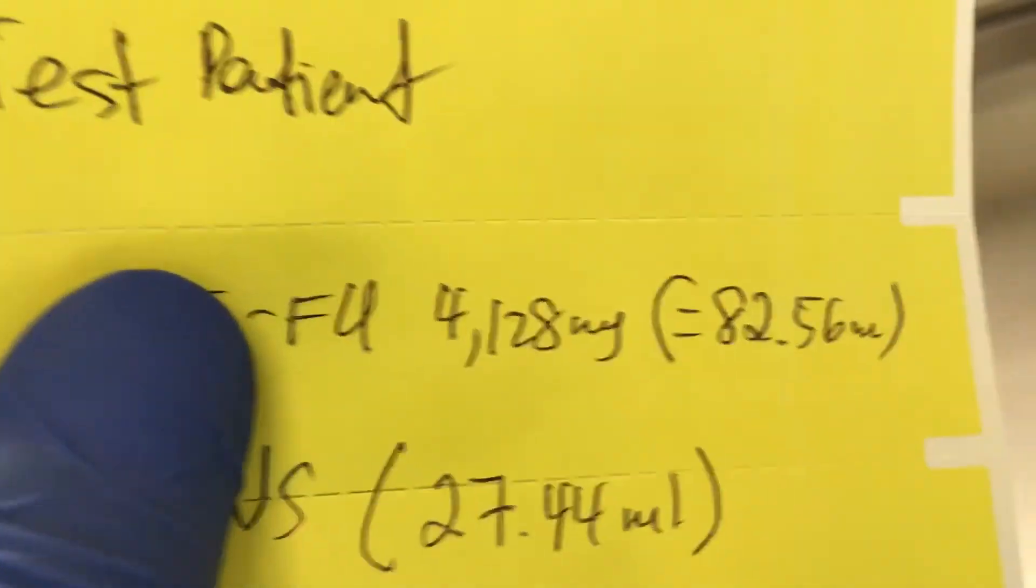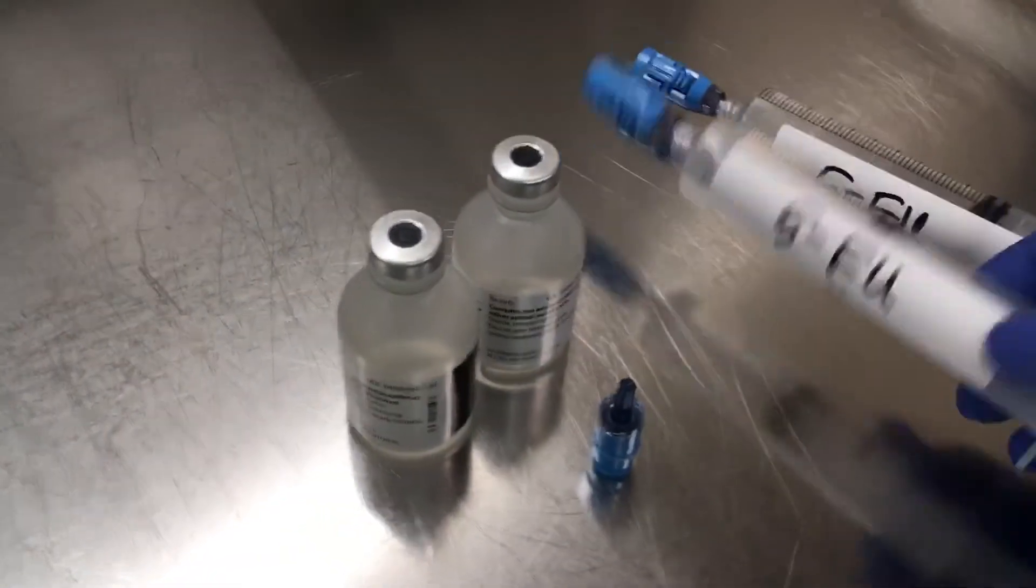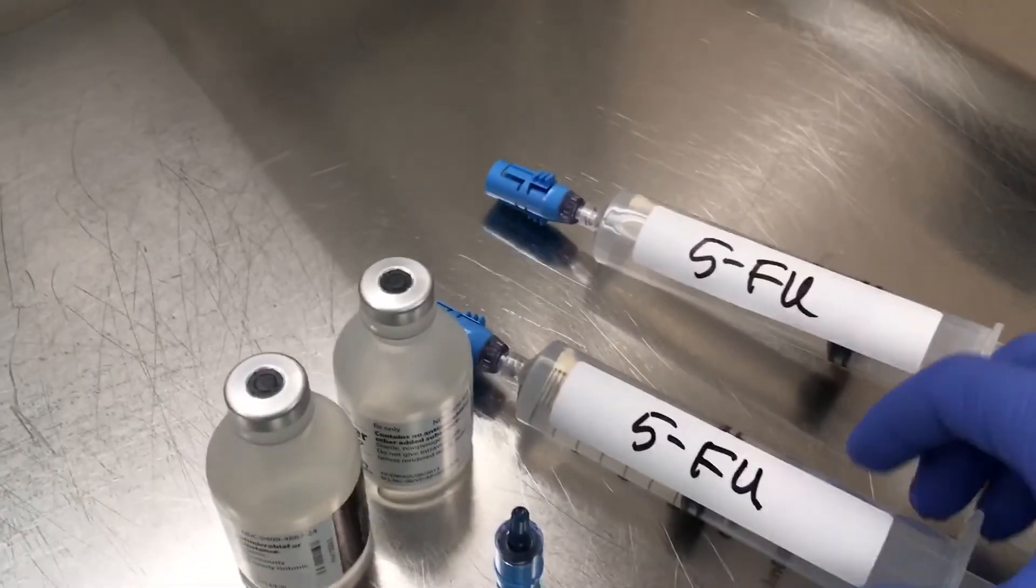Next, we're going to load 5FU. The total volume of 5FU is 82.56 ml. We have it all pre-drawn. For demonstration purposes, we use sterile water.